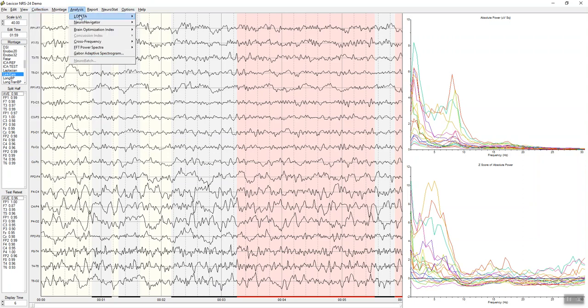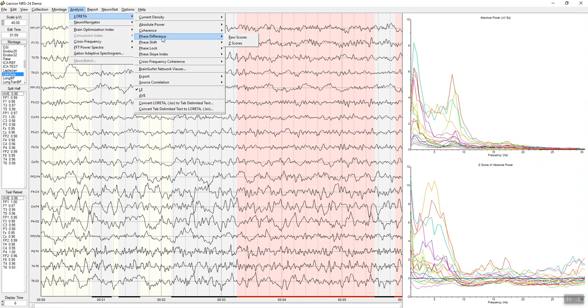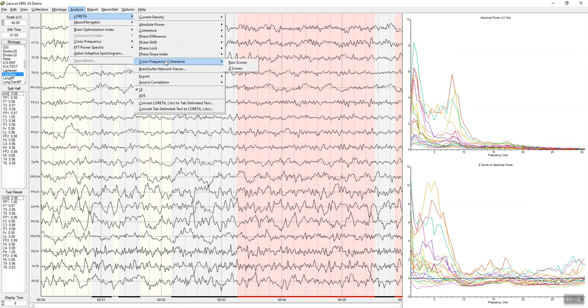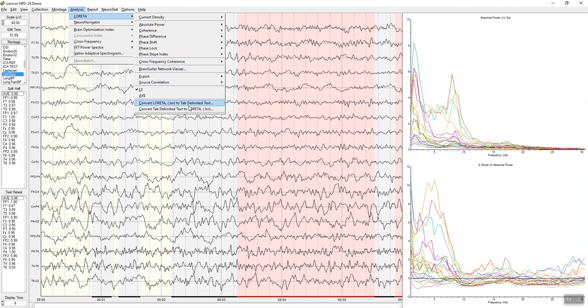Under analysis, we can use the Key Institute LORETA and sLORETA for absolute power, coherence, phase differences, phase shift, phase lock, as well as the phase slope index. Cross-frequency coherence can be evaluated. Brain Surfer Network Viewer, that's really brain-computer interface, source correlations. You can export LORETA and Key Institute to tab-delimited format.